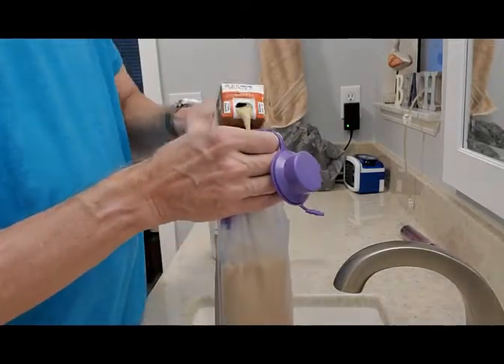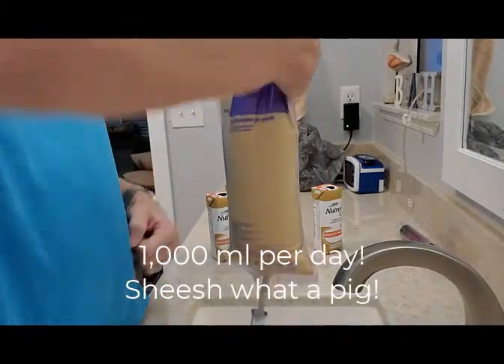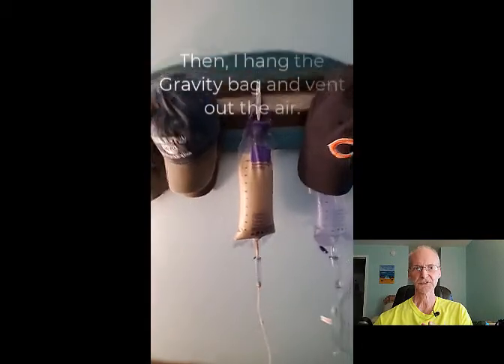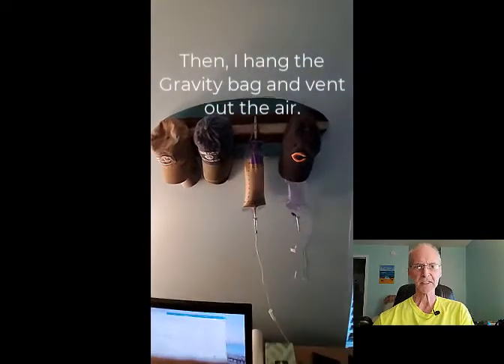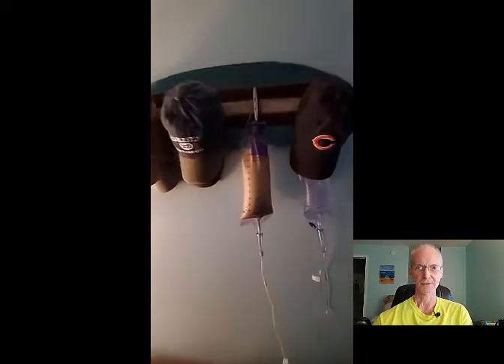This is the same no matter what, either pump or gravity, and it depends upon your nutrition how you pour it in. There are different ways to do that. I might deal with that in another video. Then you hang the gravity bag. I installed this hat rack that allows me to hang the bag up on the hat rack.